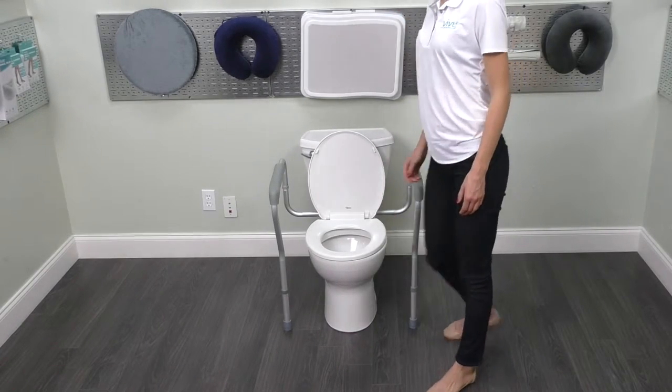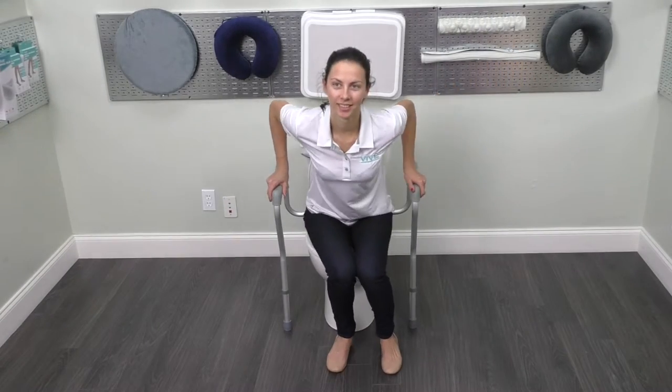Hi, I'm Karen from vivehealth.com. The Vive Toilet Safety Rail is a bathroom safety product designed to protect the disabled and elderly. It easily mounts onto toilets to provide the user with a sturdy support that makes sitting down and standing up safe and easy.